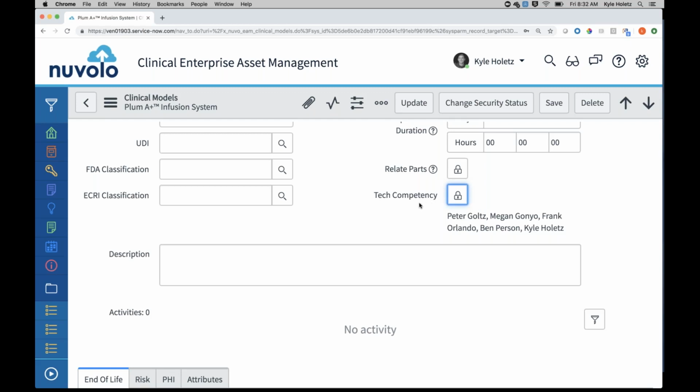In our out-of-the-box system, we keep it pretty vanilla, right? Because of these exact examples, everybody's gonna do it a little bit differently, and that's kind of what we talked about a second ago. But it's all formula driven, so we can pull things like that out. And that's a great point, pulling out things like service providers or a service PO linked to that work order. Do not include those in your competency verification.